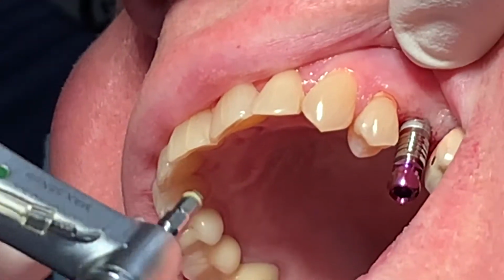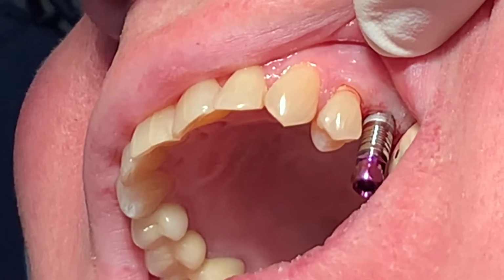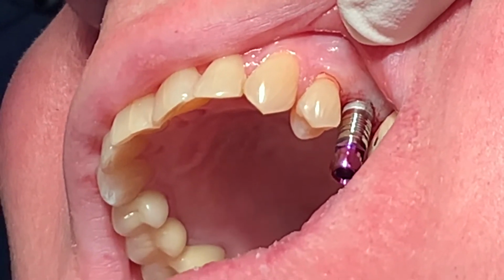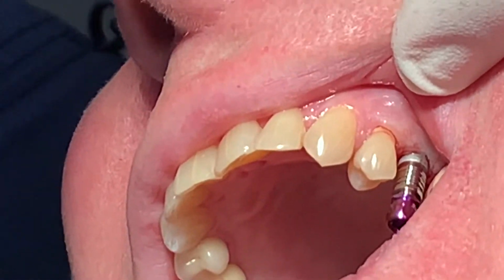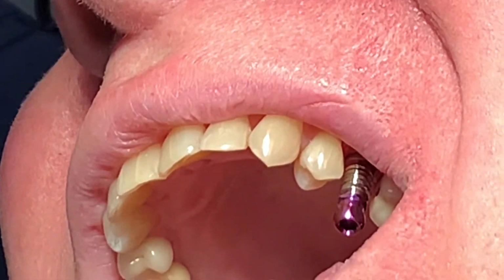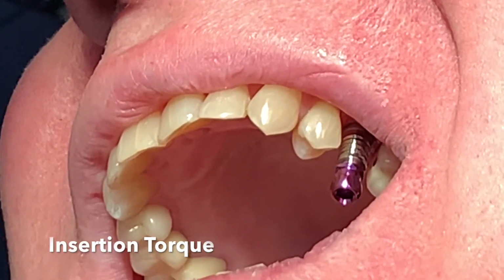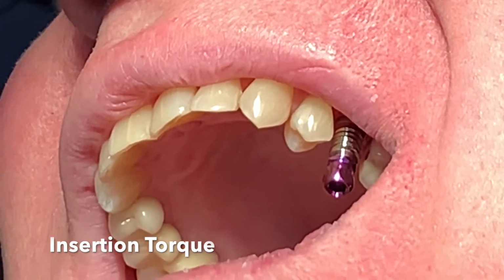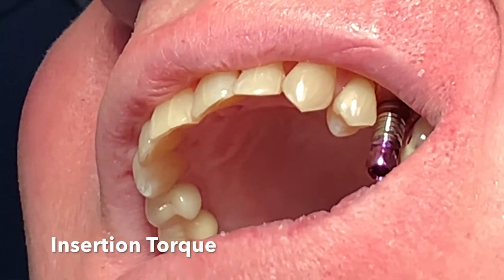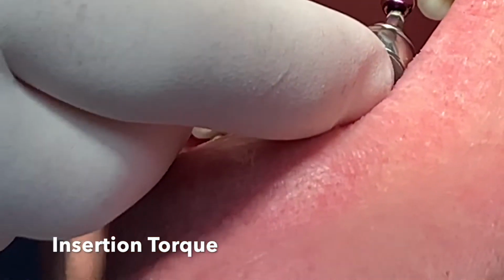And so if you look, the implant is in, but it has not gone down to length. You know, sometimes if I'm close to length, I'll just use a ratchet and kind of stretch the bone using the implant as an osteotome. But in this case, I got a little ways to go. So Doc, what do you think about using a crestal bone drill? No, just ratchet it in. Just ratchet it in? Yes. All right. You're the boss, Doc.